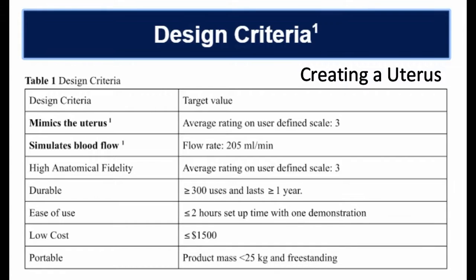This semester, our group created an accurate model of the female abdomen postpartum that mimics the elasticity of the human body, the pressures produced in the uterus, and the blood flow circulation. Our belly dummy integrated a latex tubing flow rate system, ballistic gels, pressure sensors, and mock silicone organs to create a functioning masterpiece. The design criteria of our belly dummy included mimicking a uterus postpartum in an anatomically accurate way, as well as incorporating a circulatory system to simulate blood flow.